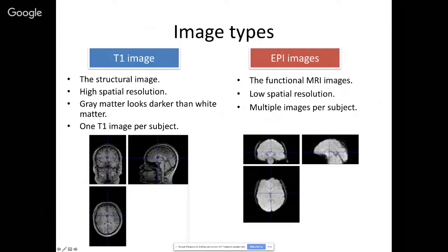So we have higher temporal resolution, but we have to sacrifice our spatial resolution. So we have 1 second per image, but we collect 30 minutes for each subject. Means we have multiple images per subject, right? Each 1 second, we have 1 image. That's it.